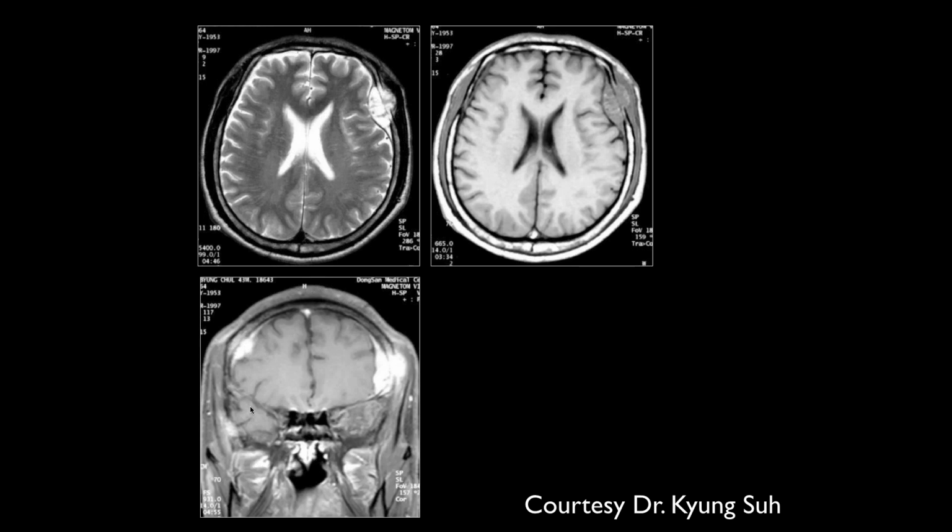So it looks like we've got an extra-axial mass there as well. You could have multiple paragangliomas, I guess.